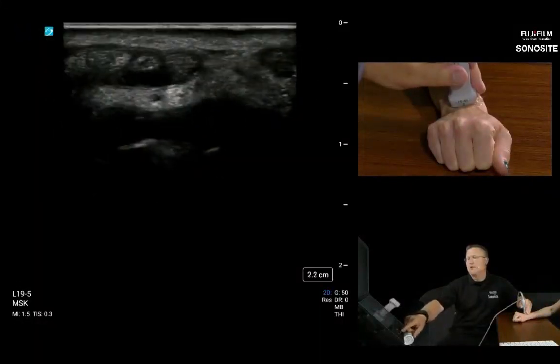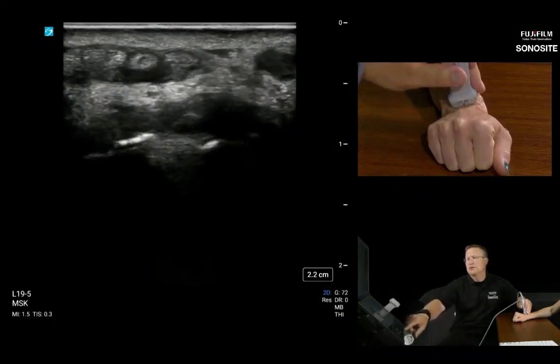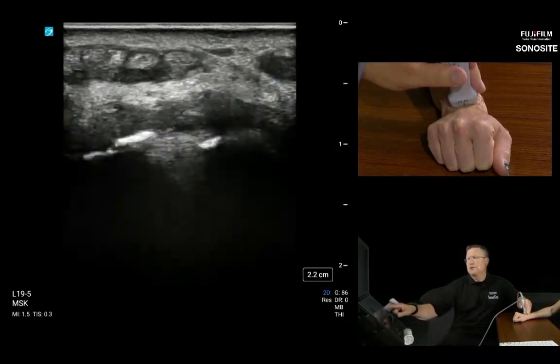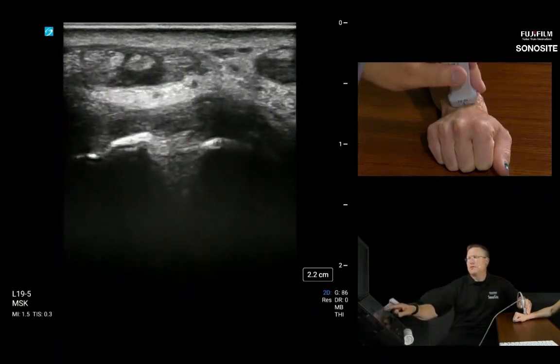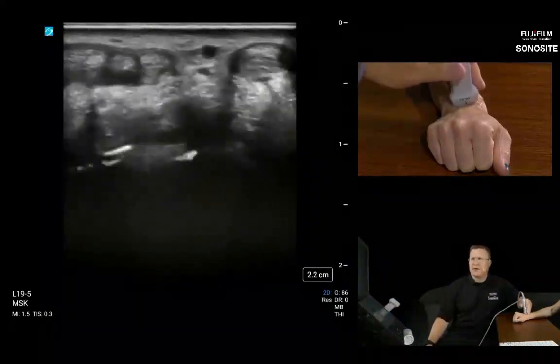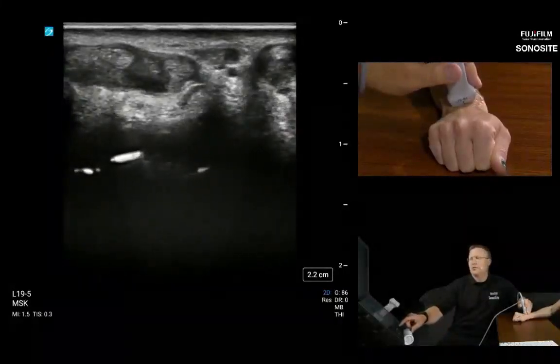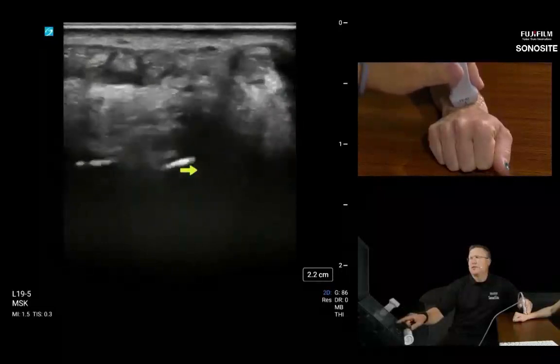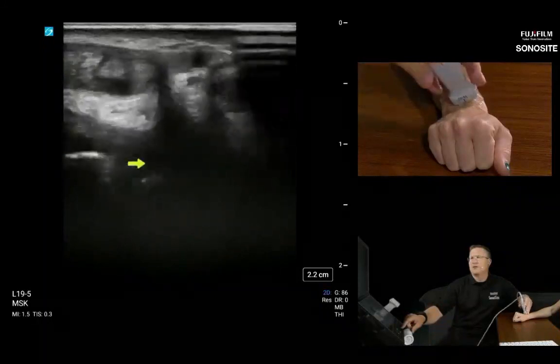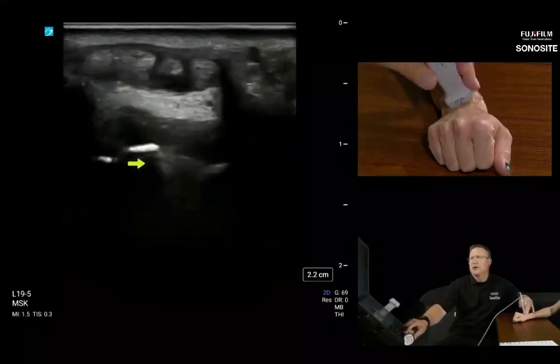Go down, hit auto, and then what we're going to want to do is just crank the gain just a touch. Turn on our TGC, and we're going to crank up a little bit of the far field gain there. And it can help to squeeze a tennis ball, which I don't have with me right now, but just even squeezing something like a tennis ball is what's really going to activate, hey, do we see a gaping in this ligament? Do we see a ganglion cyst really show itself? Those are all things that are really going to help out when doing a dynamic evaluation.